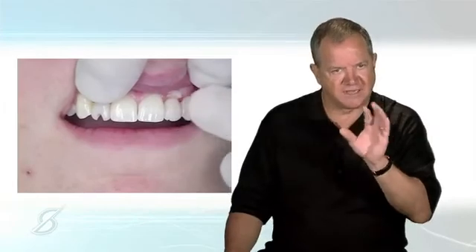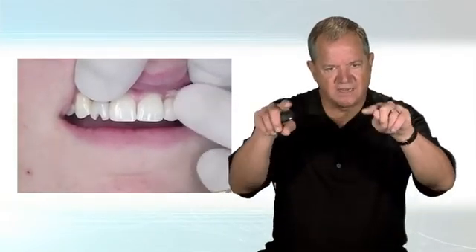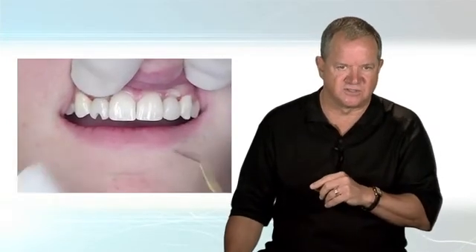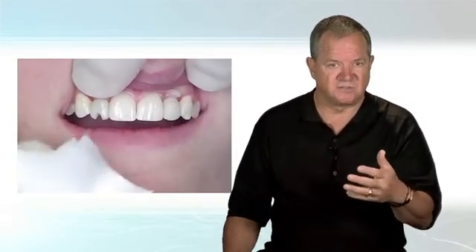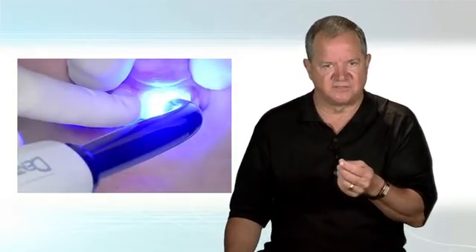But the opacious dentin blocks the light passing through, and it keeps it from getting that gray, because otherwise these both would show a nice gray circle where the screw access hole is. So by using the opacious composite to fill the access hole, I'm going to get basically an invisible finish of the composite that's filling that hole.